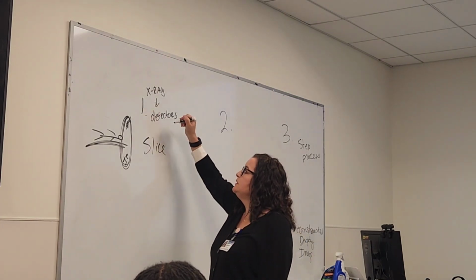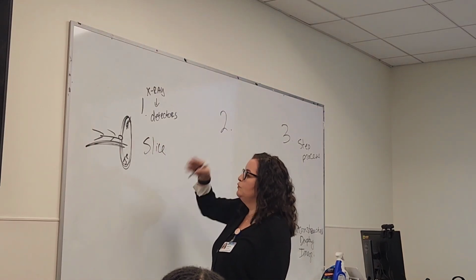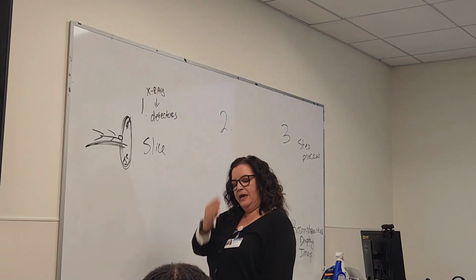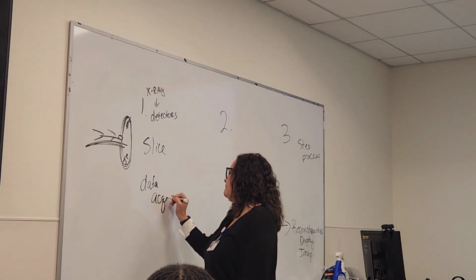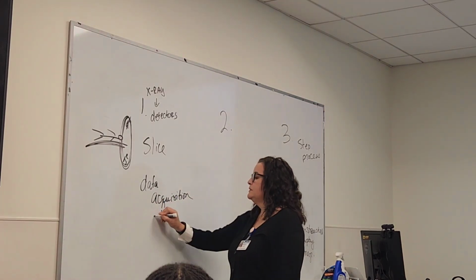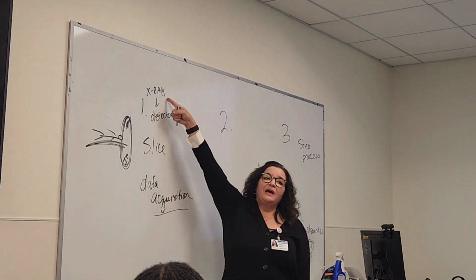So the X-ray is going to make contact with the detectors, and the body is going to continue to move, and it's going to take pictures or take images as the body's moving through. It is acquiring data. So when we think of the word acquisition, we're saying acquiring. We can't get data until we got an X-ray.